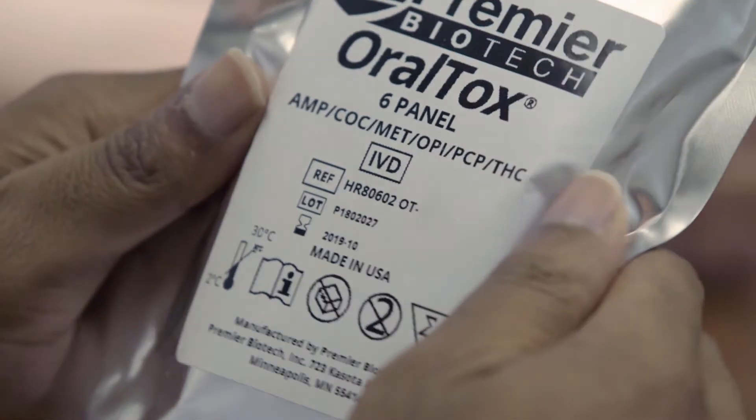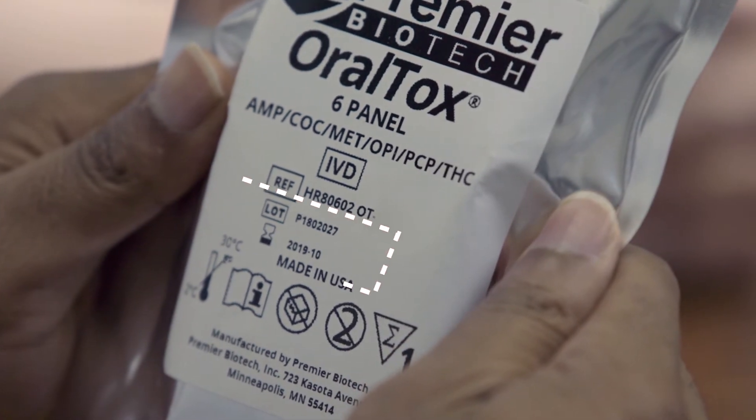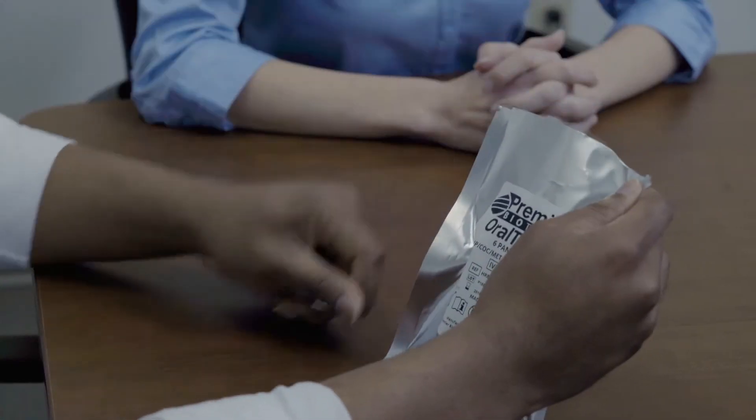Check the lot number and expiration date. To aid in collecting enough oral fluid, the donor should be instructed to pool oral fluid prior to collection. Open the foil pouch and hand the OralTox collector swab to the donor.